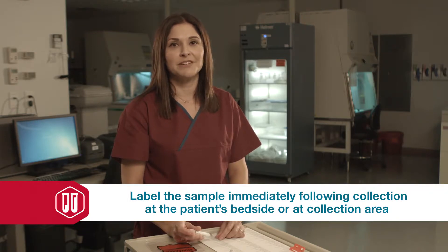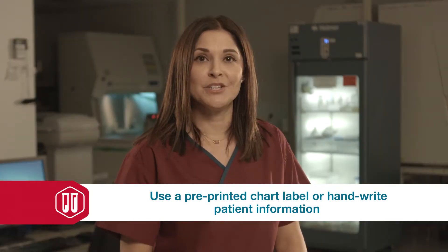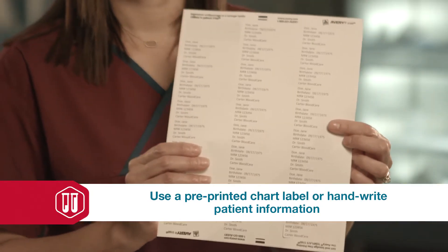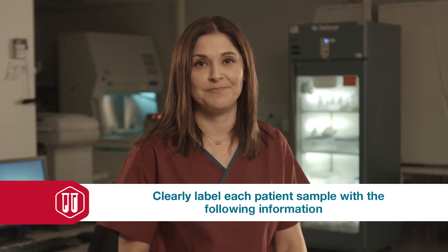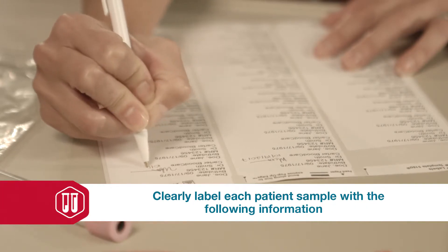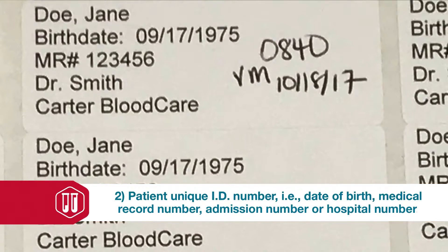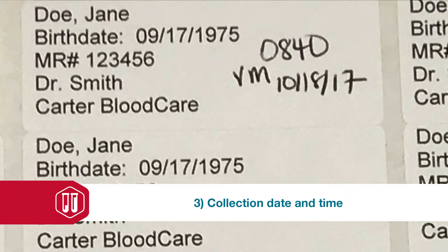This helps prevent misidentification errors. There are two options for labeling a patient sample: one, you can use pre-printed chart labels, or two, you can simply handwrite the information. Regardless of whichever option you choose, the sample must include the following information: patient name, patient date of birth, or other unique identifiers such as the medical record number, admission number, or hospital number. You should refer to your internal policies to make sure you're using the appropriate unique identifier. You also need to include the collection date and time and the collector's initials.